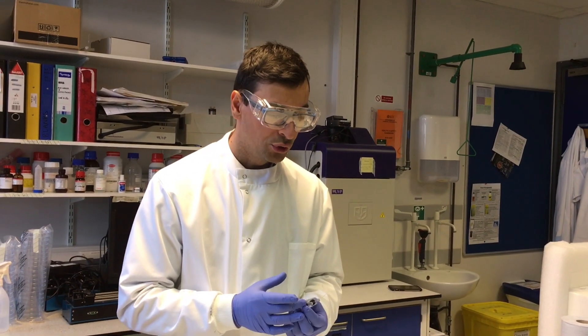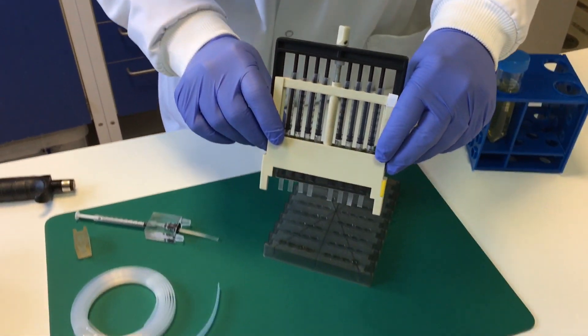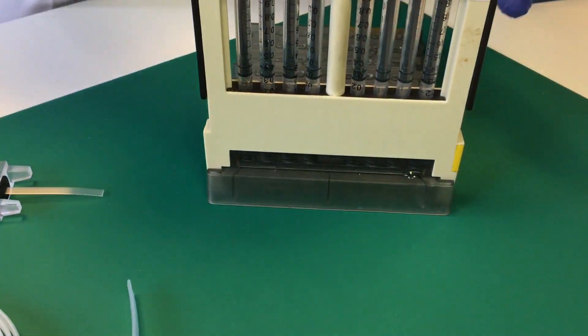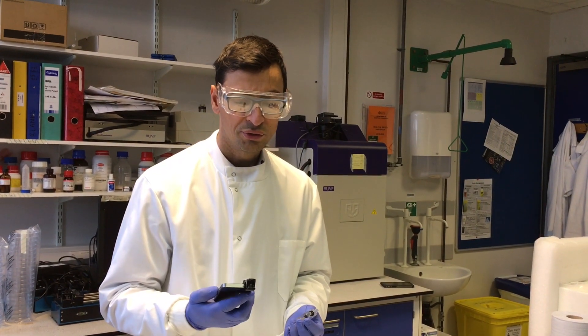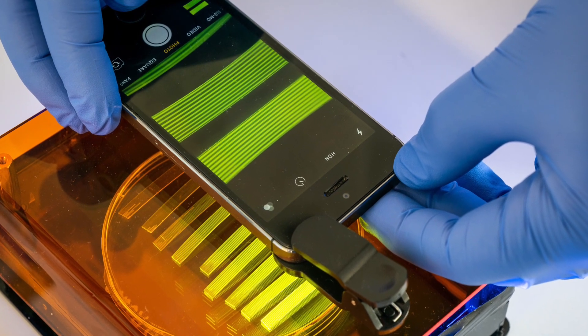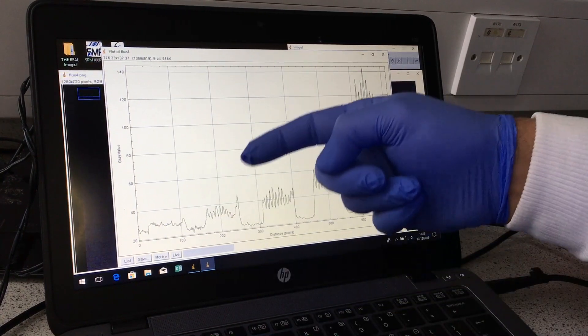First, we collect the urine sample. Second, we use these small micro capillaries to do immunodetection and capture of the bacteria, after which we load a number of reagents. The full procedure takes about 20-25 minutes. Finally, we use a conventional smartphone to take a picture of the strip, from where we can work out the presence of bacteria from the peak cell intensity.